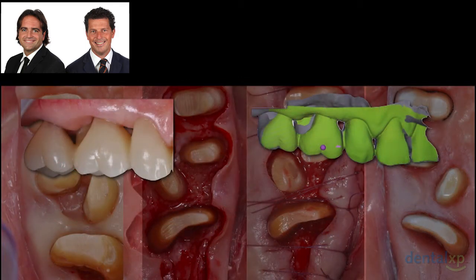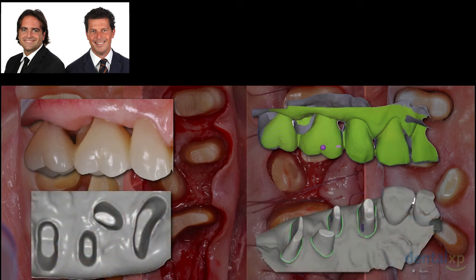Look at the top left picture, the perfectly shaped provisional restoration in place, functionalized by the patient. Thanks to the new technologies and new materials today, we are able to duplicate in a predictable way the function done by the patient with the provisional restoration. It is in fact recorded with the dental abutments, and once all the scans are matched, the final restoration is produced.